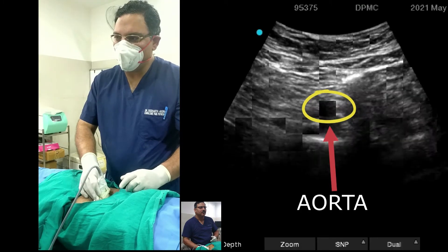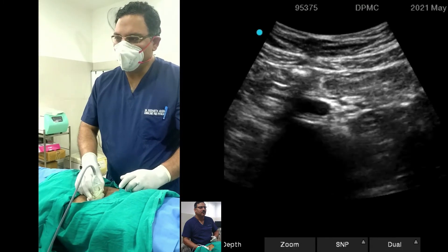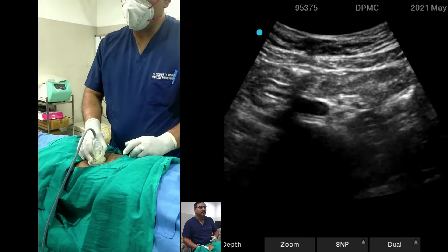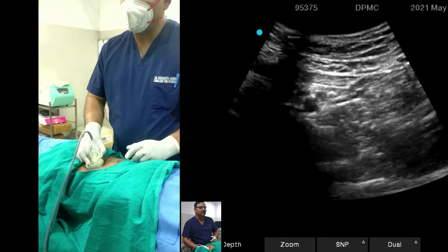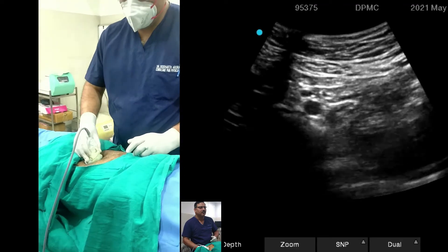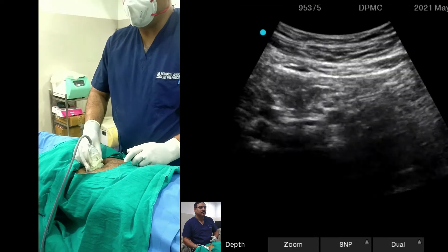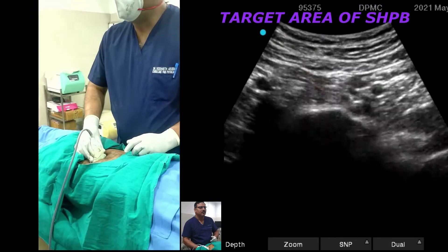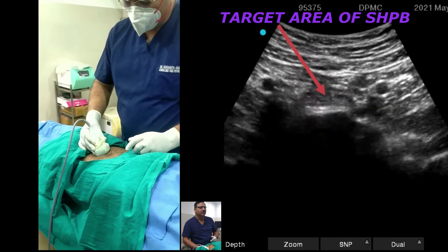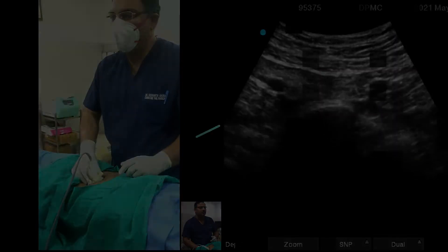You will be able to see the single aorta at this level, as I am seeing. And once you go down, you will be able to see the division as the aorta divides into the iliac vessels on both sides — right and left. You will also be able to see the bone, which will mostly be the L5 bone. On both sides, I am now able to visualize the iliac vessels very clearly.